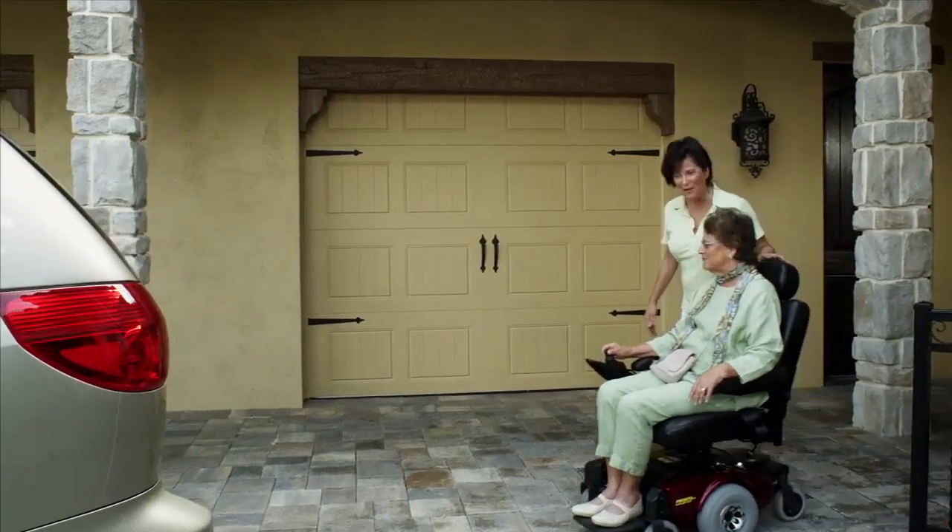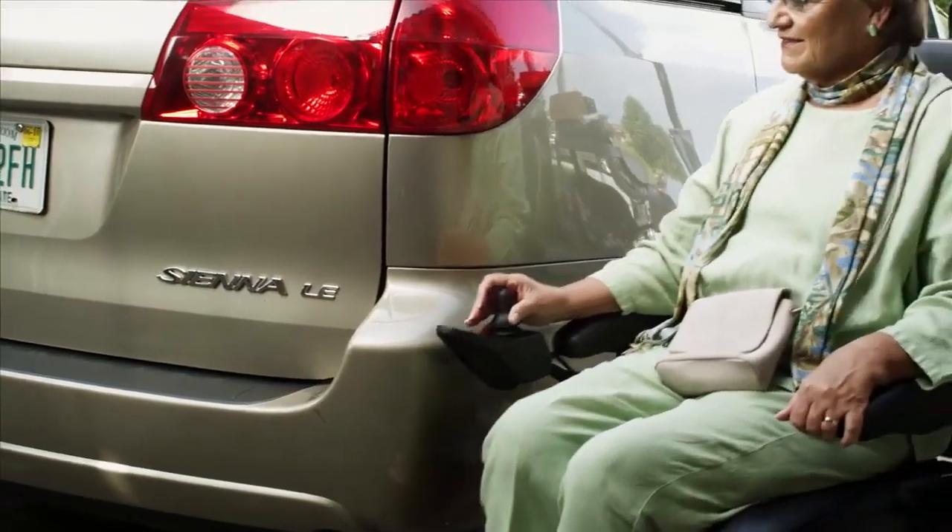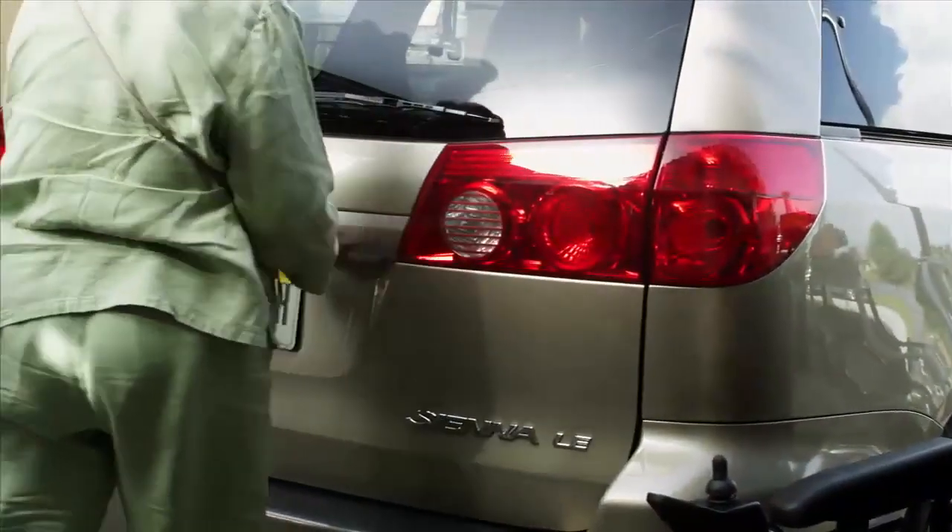Going out for lunch at a movie is a very important time together for mom and her daughter. And taking mom's power chair with them is an easy task with their Harmar Premium Inside Lift.